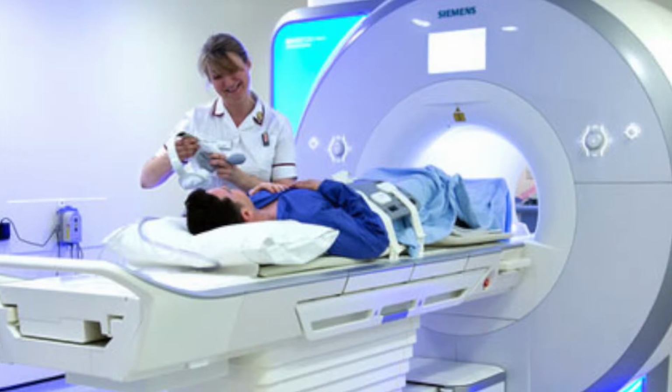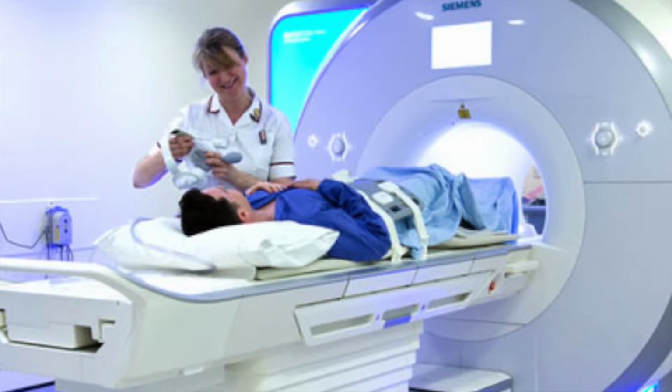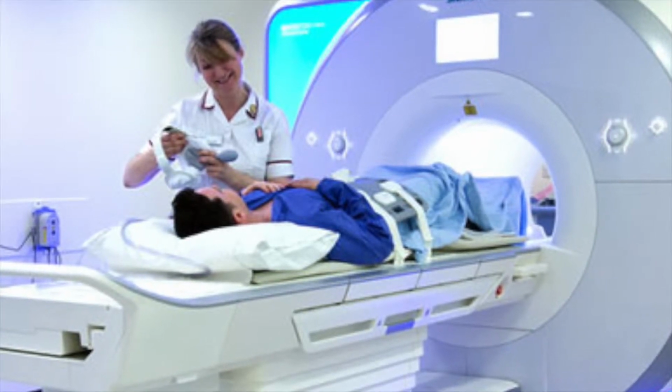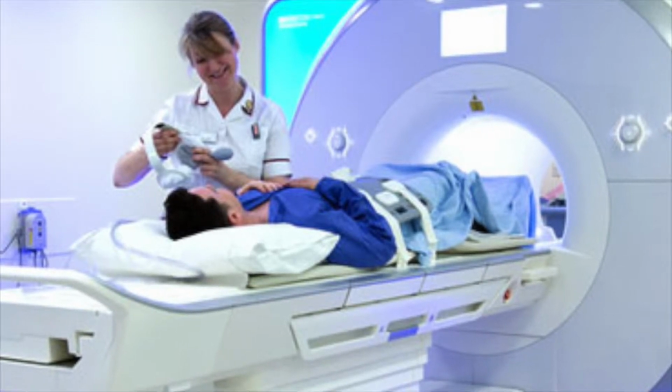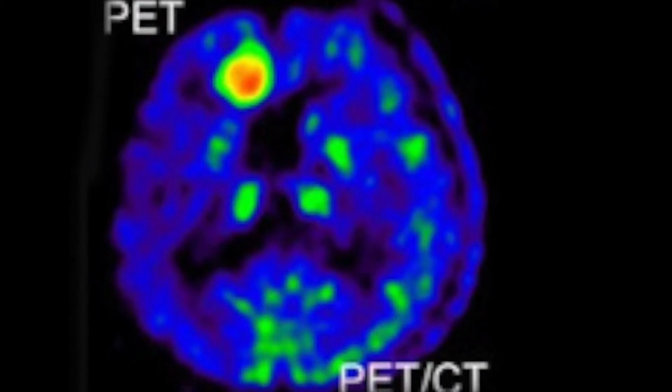An MRI, magnetic resonance imaging scanner, is a medical investigation device that uses an exceptionally strong magnet and radio frequency waves to generate images of the body. This device is usually used for detecting issues with a patient's tissue, sports injuries, spinal injuries, and tumors. Now back to the PET MRI scanner.